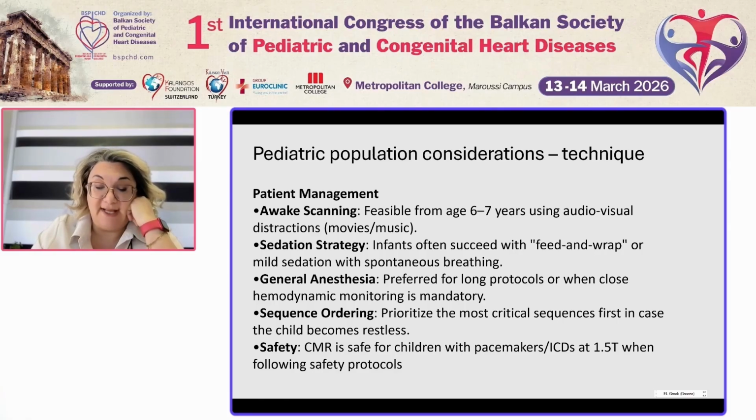For school-aged children, typically from the age of 6 to 7 years, CMR can be performed without sedation, especially with audiovisual distraction, such as music or movies. In infants and very young children, cooperation is limited, so sometimes a feed and wrap technique or mild sedation can be used.